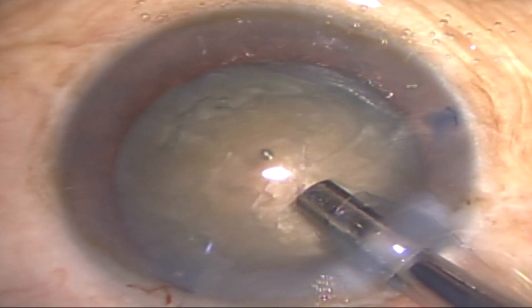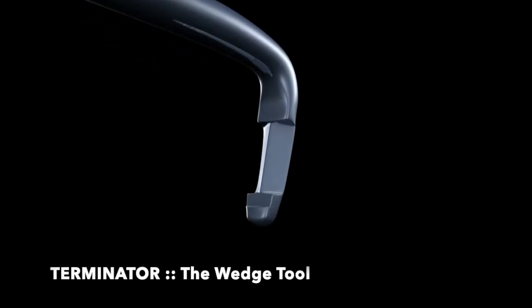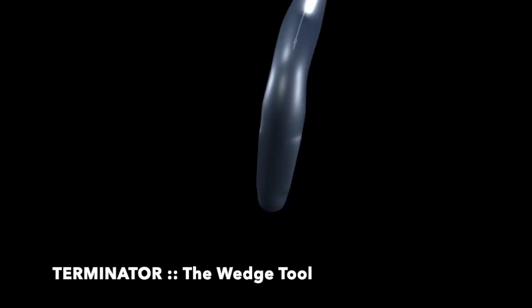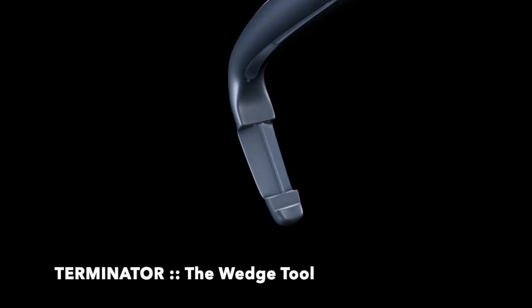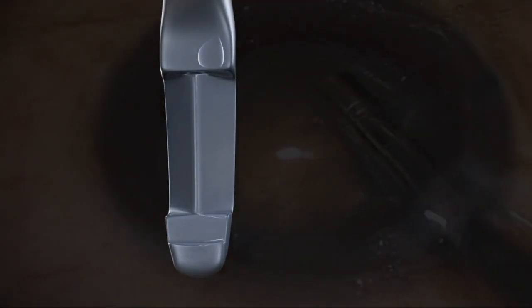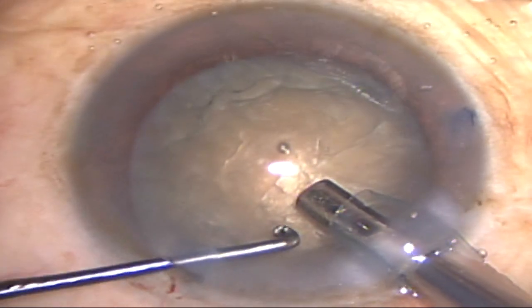To manage this nucleus, I have planned to use a special device to crack it. This device is called the Terminator, the wedge tool. It has a wedge inner edge so it functions like a cracker, not like a chopper. When this device is hooked around the nucleus, it gives a transversal fracture force, which is a cracking force — it cracks the nucleus into two pieces.